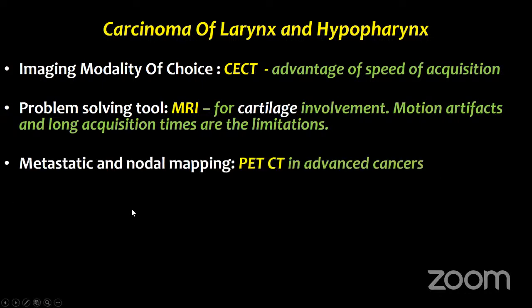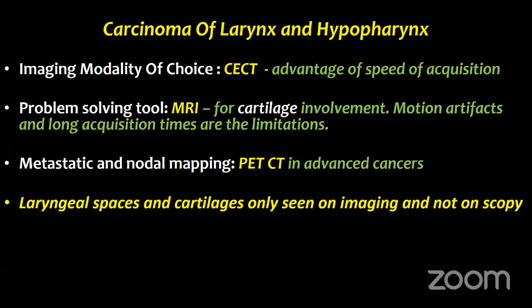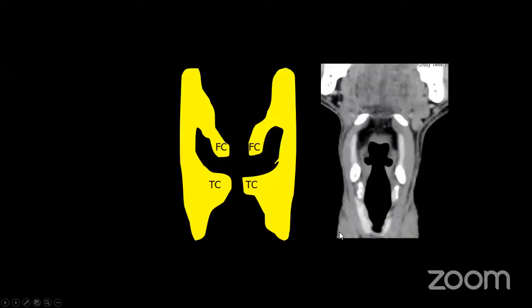Given that the hypopharyngeal malignancies are quite aggressive, they have a large nodal burden and can be advanced. In such cases, PET-CT or NCCT thorax can be added onto the staging workup of these patients to rule out any pulmonary metastasis or bony metastasis. So, what are the key spaces we will see in the anatomy which are important and seen only on imaging? Starting from how do we divide the larynx?